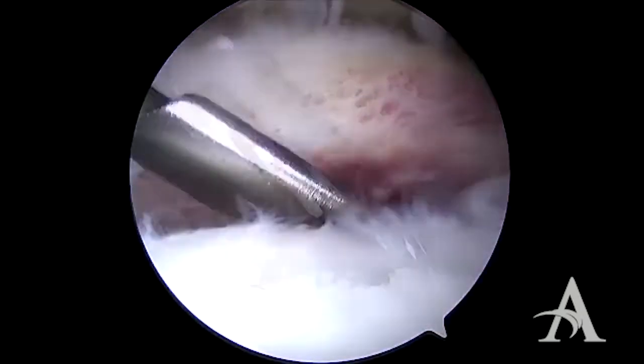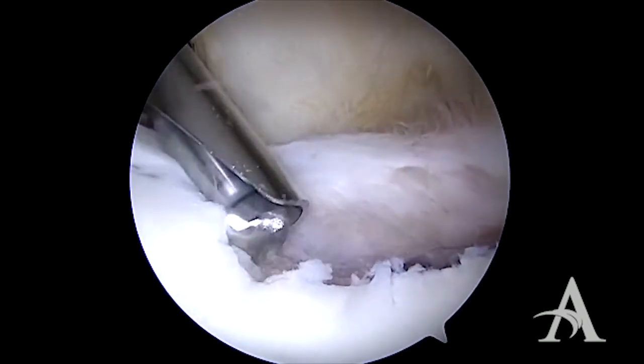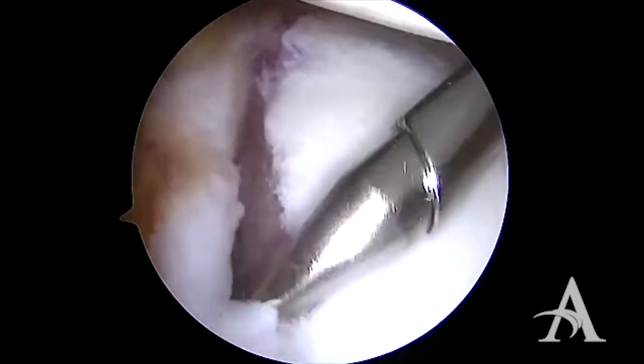Once the soft tissue is elevated, a burr is brought in and the anterior glenoid is debrided to stimulate a healing response. Our preparation can be visualized from the anterior cannula.